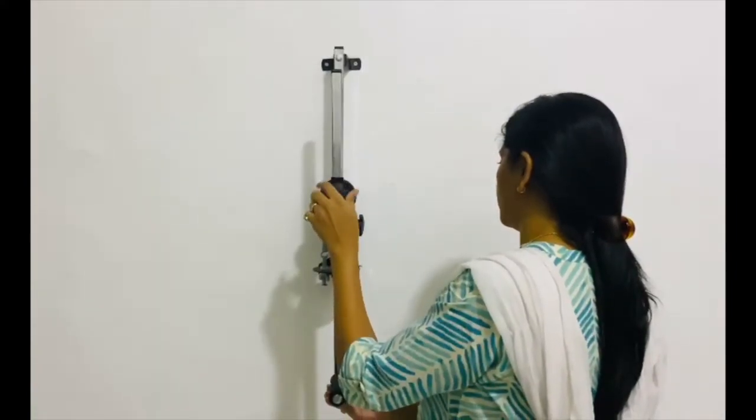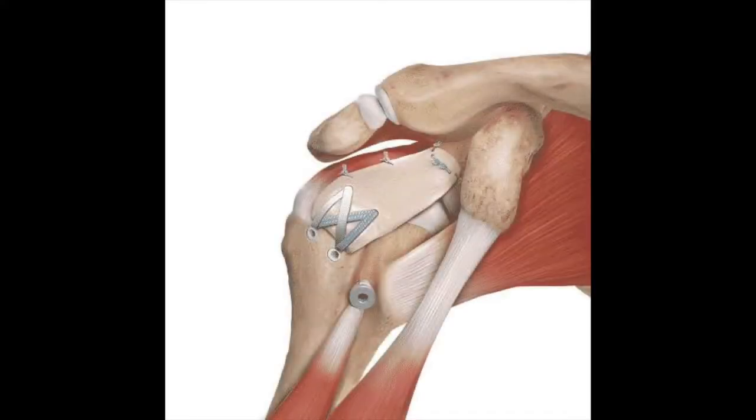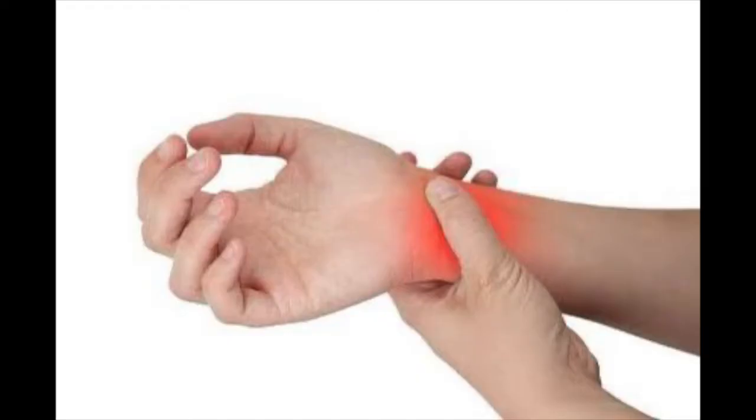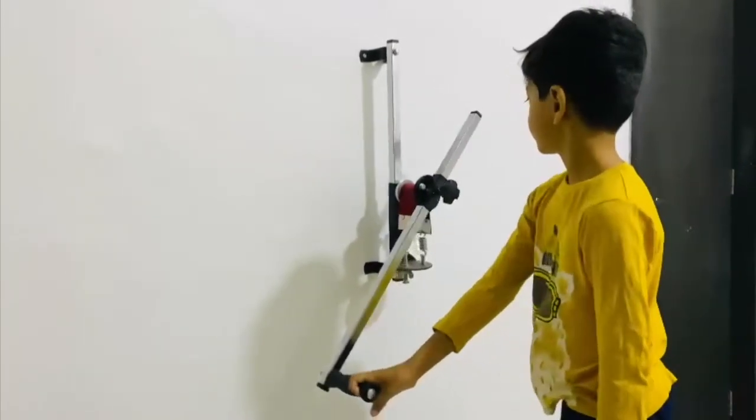The shoulder wheel is used to increase mobility at the shoulder joint, elbow joint, and wrist joint. It progressively strengthens the muscles of the upper limb. How to use the shoulder wheel: patient stands facing the shoulder wheel.